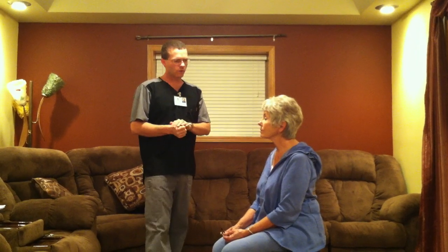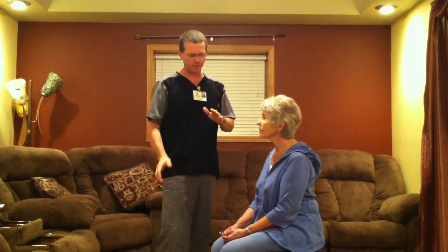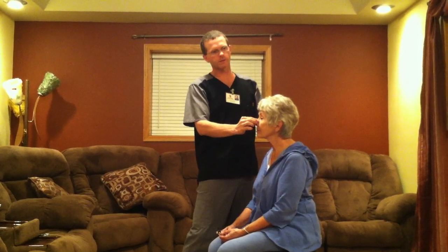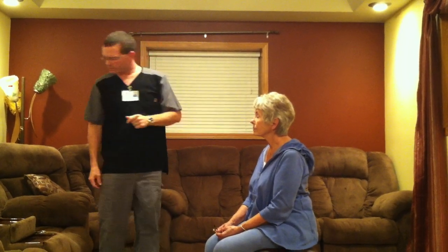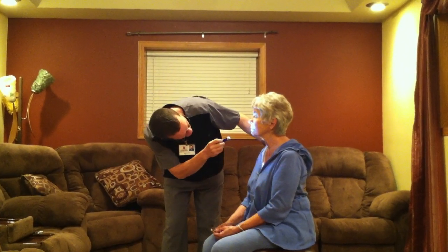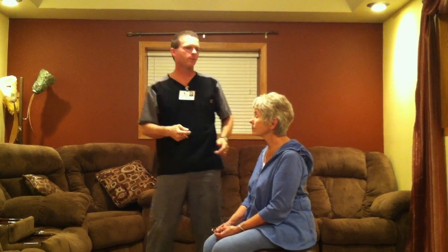Moving forward to the nose, again we will inspect the nose for symmetry, side to side, skin color, any presence of lesions. We can palpate the nose for tenderness and crepitus, and there is none noted. The inner nose would be assessed with an otoscope once again. We'd assess for any internal drainage, internal redness.